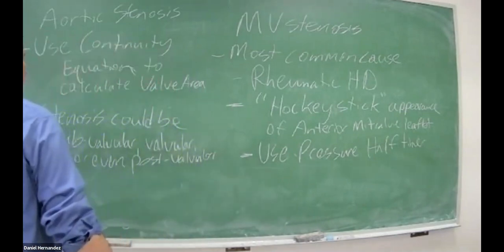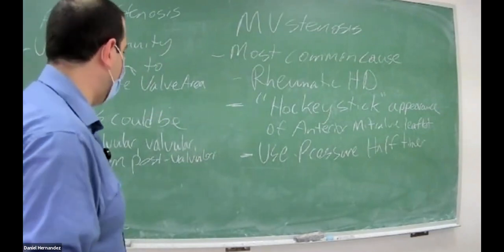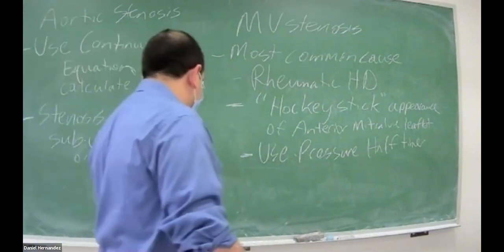So we can have stenosis below the level of the valve in our LVOT, we can have valvular stenosis, or even post-valvular.